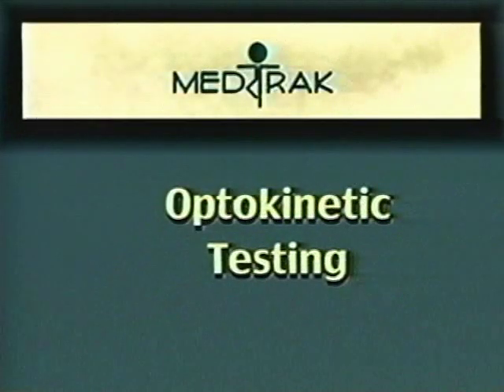The next portion of the oculomotor battery is the optokinetic testing. This particular type of testing is again designed to demonstrate central nervous system vestibular pathology. It primarily depends upon the tracking of involuntary, large, slow-moving, repetitive type images where nystagmus or abnormal eye motion is actually normal and is induced by the maneuver itself. It requires a full field retinal stimulation, which is necessary for true OPK testing.